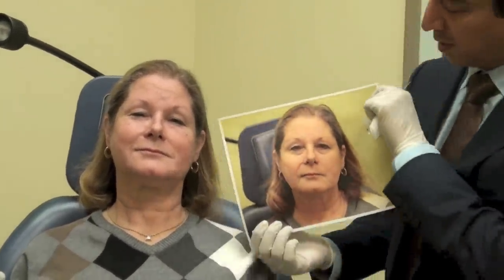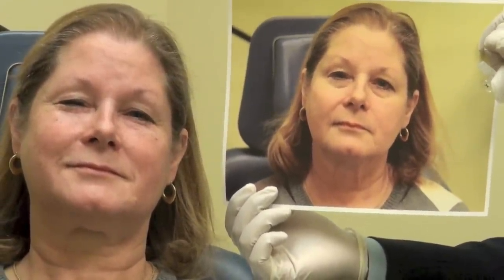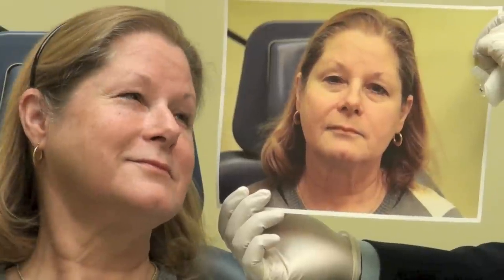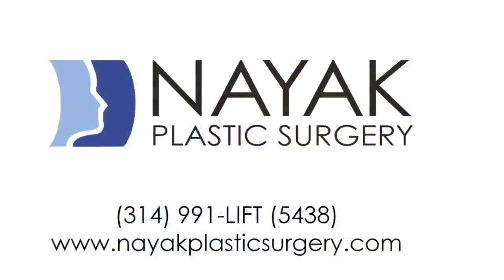We'll go back one more time and show you where we started. That's our original starting point. For about 10 minutes and not too much suffering, I think it went pretty well. Let's let her see what she looks like. Oh, wow. Yes. Much better. You did great. Thank you so much.